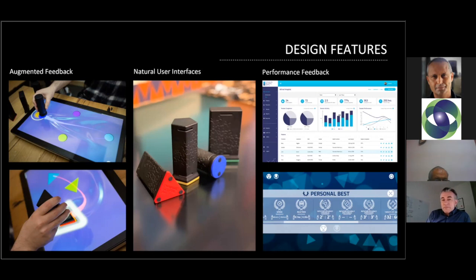As I mentioned, we are recording data that is presented to the therapist and can be presented as a report back to the patient, but also as in-game or in-application feedback. The patients are rewarded with personal bests, depending on how they perform, as well as achievements in terms of how quickly they've been able to move. These are presented in-game, but also at the end of the session, where they can review how their tally is going in certain areas.